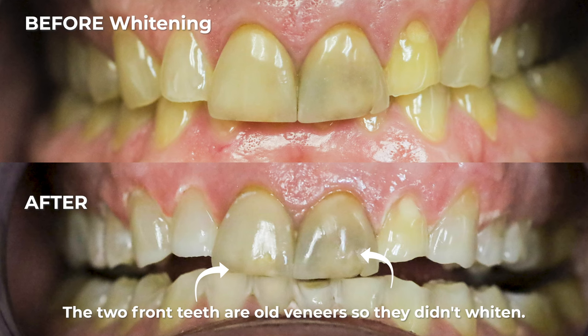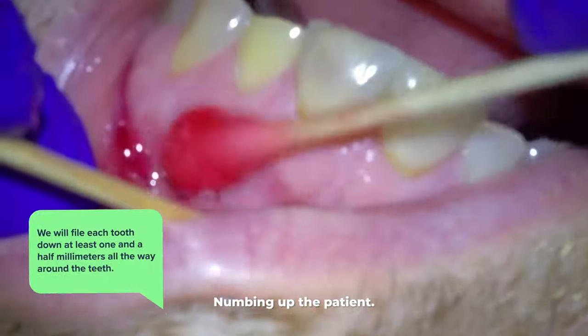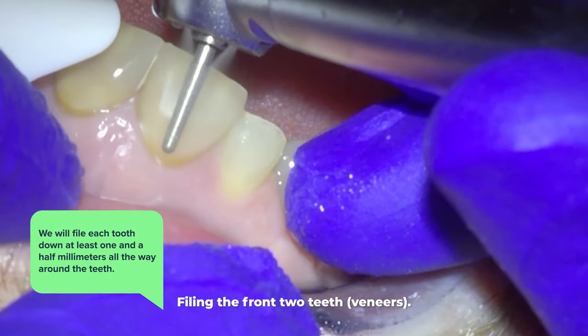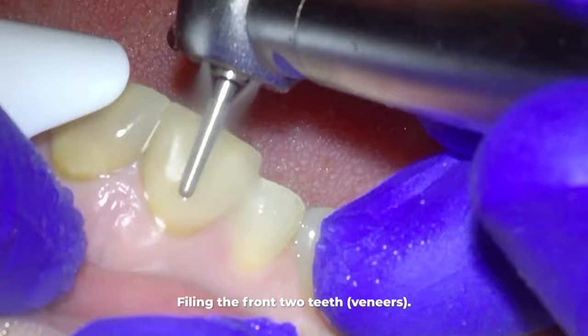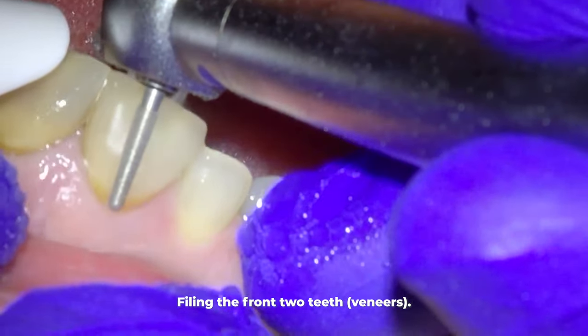At the next appointment, we will be preparing the teeth for the crowns. We start by numbing the patient because we will file each tooth down at least one and a half millimeters all the way around the circumference of the teeth. I normally start with the front two teeth, which happen to be the veneers in this case, and so we start by removing the veneers.